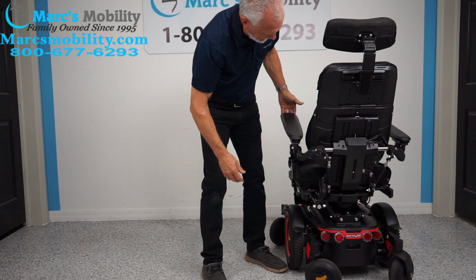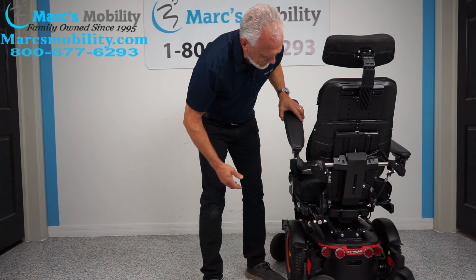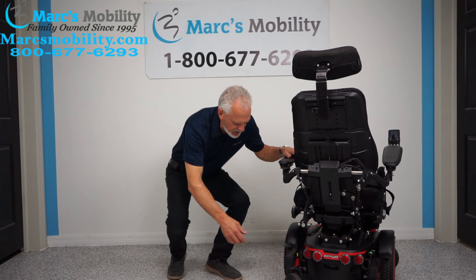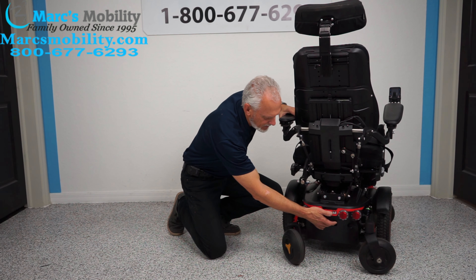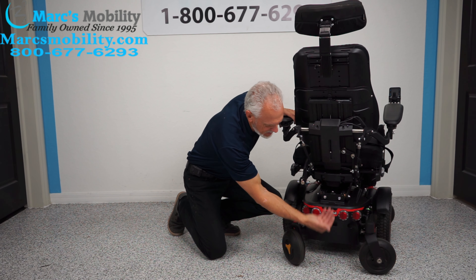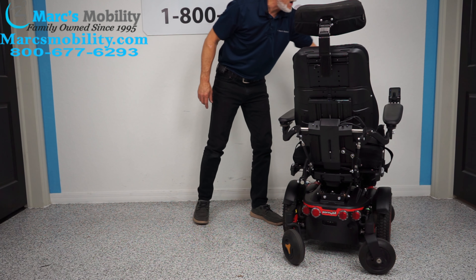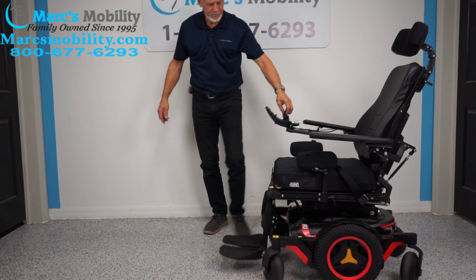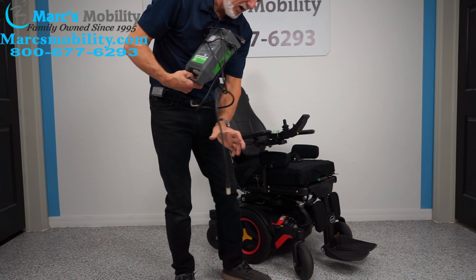The cylinders here adjust the arm angle — turning them tips the arm up, giving you tilt on your arm pads, one for each side. Right behind the chair there is a power button. When you receive these chairs, we usually turn the power off here. You'll hear it power off completely. To restore power, put your fingers in, go up, and pull it to the left. You still need to turn the power back on at the front of the chair to activate it.